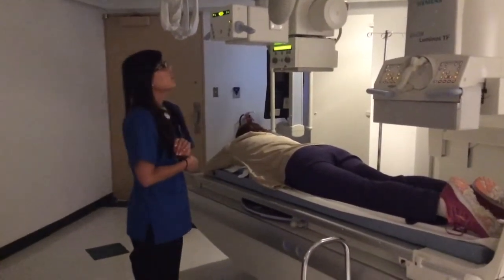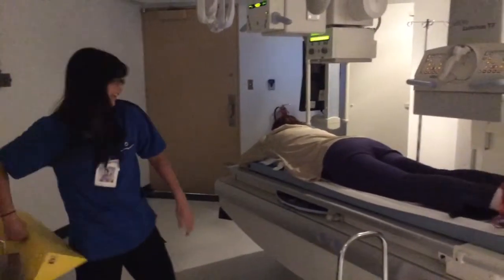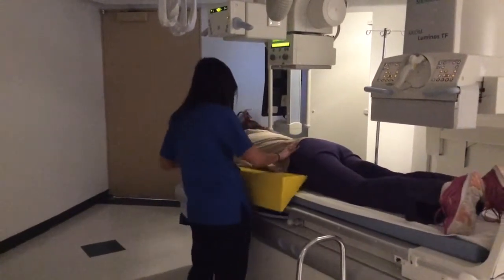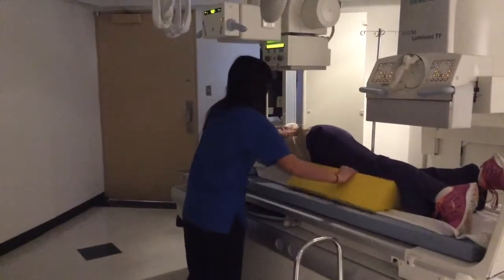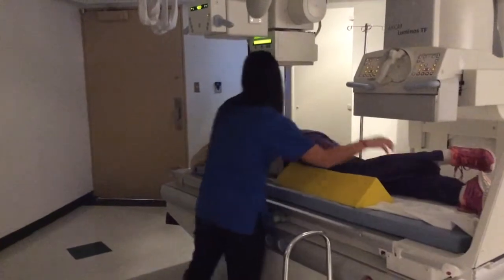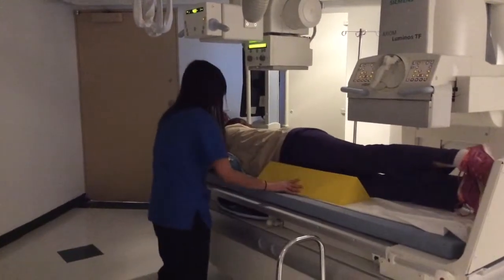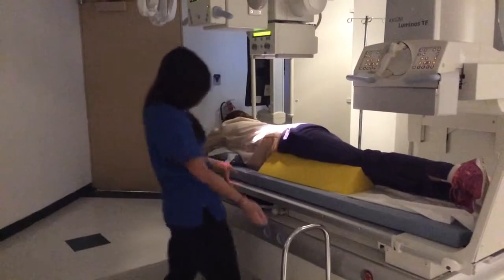After we have verified that barium has reached the large intestine, we would then do an RAO position. So I would like my patient 45 degrees. Cushion here, you can bend this knee. Okay. Recenter.